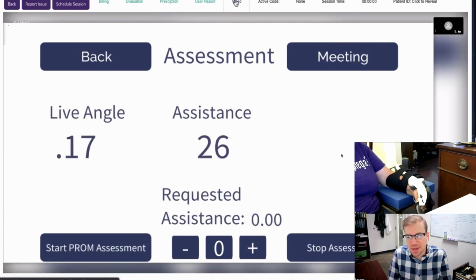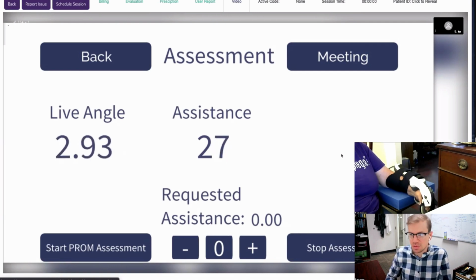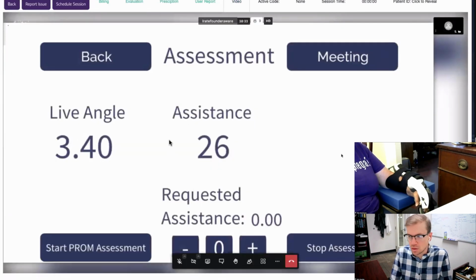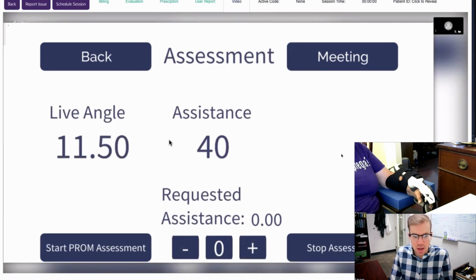When you have that assistance, you actually are able to move up into extension. I hope you're appreciating that right now. Yes. So as those numbers are going up, this is really, really good. Let's keep going up, keep going up. Very good. Okay. Relax for me here. A little bit more there. Okay. Now I'm going to have you go up again as far as you can. Great. I'm going to have you go down into flexion.